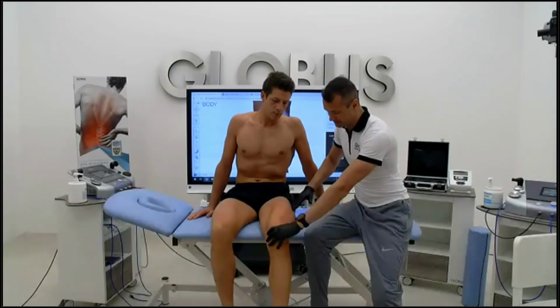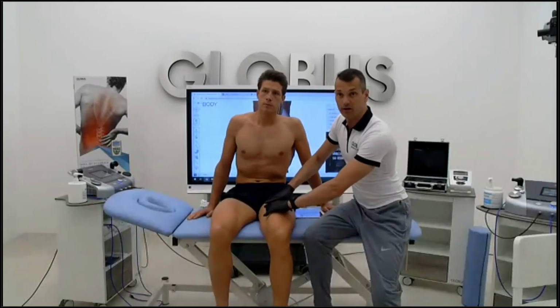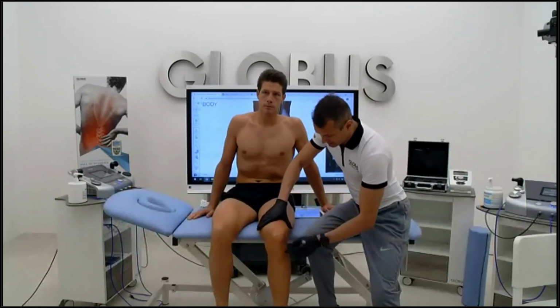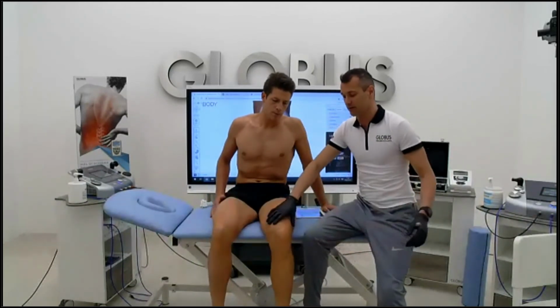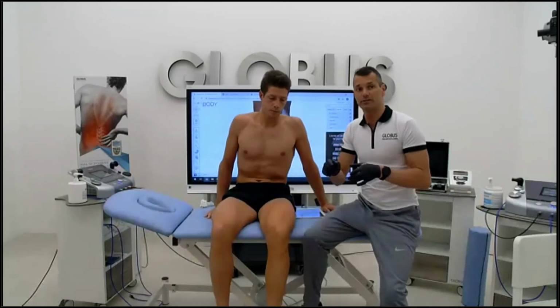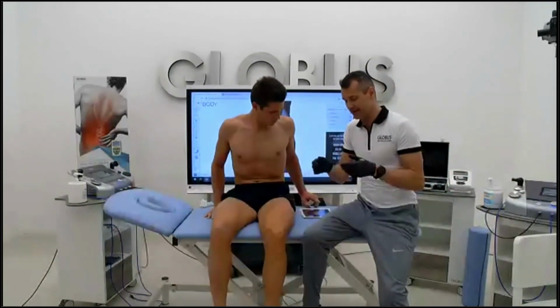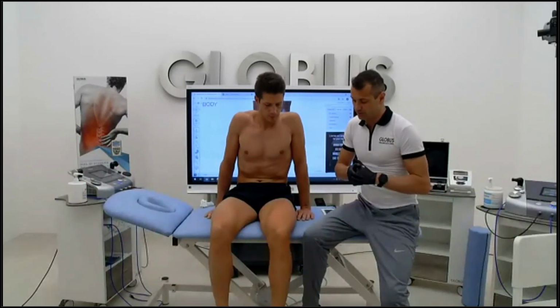There was a lot of stiffness here, so we resolved all the muscle contraction. And by the way, I also did some manual mobilization of the patella, also with the tools, as maybe you have seen with the Dia Ball or small Dia Blade, that also help us mobilize the patella.